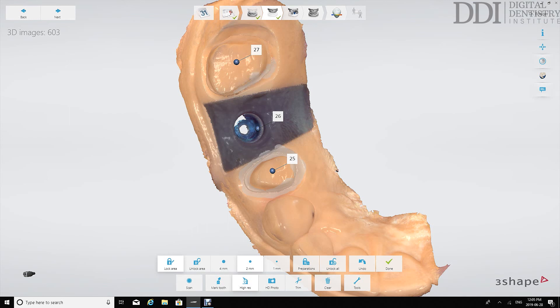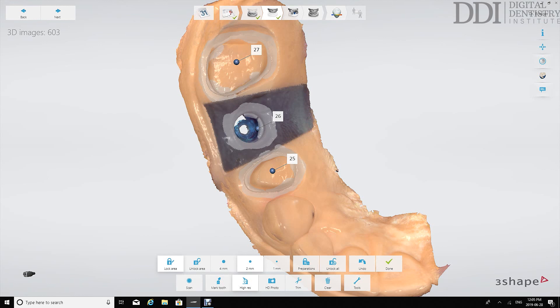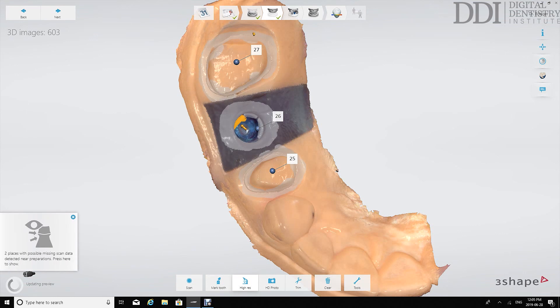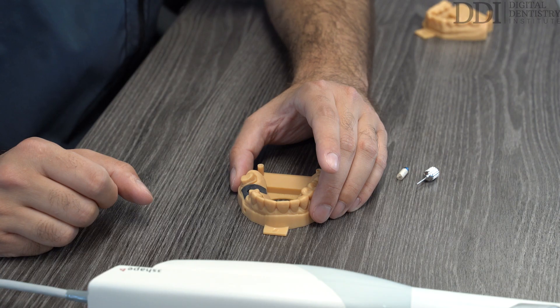So we're just locking the surfaces around those margins and soft tissue and what we'll also do is we will lock the surfaces around the emergence profile that we've captured because again as we take the time to insert the scan body and retake the scan that emergence profile might start to change. So we've locked those surfaces and are now able to move on to the next scan which is the scan body scan.